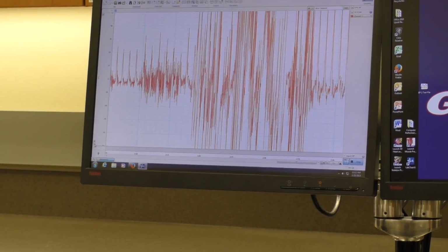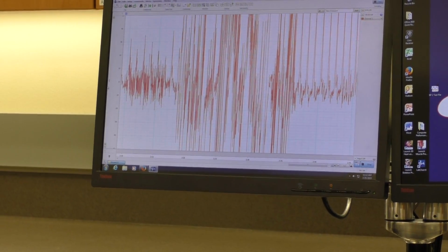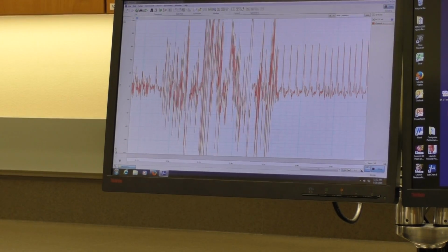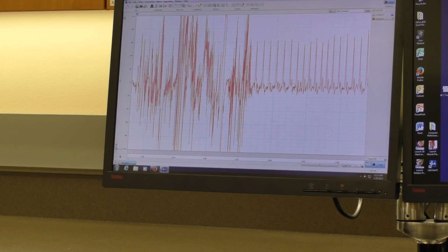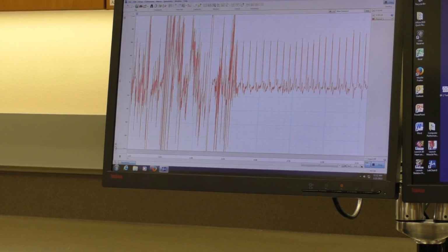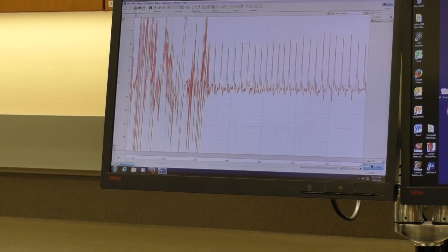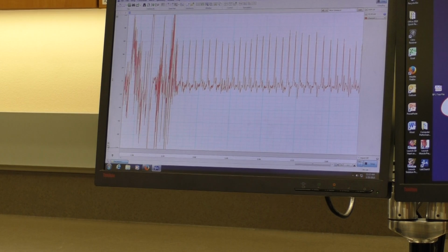Okay, so those changes made it a much cleaner signal. I do have to make just a brief adjustment in my range, and if I click minus over here, okay, now it's perfect. So don't get frustrated, just make sure that your hookup is good. Make sure that you're reducing any electromagnetic fields. They can come from someone's laptop, they can come from the monitor, anything like that.